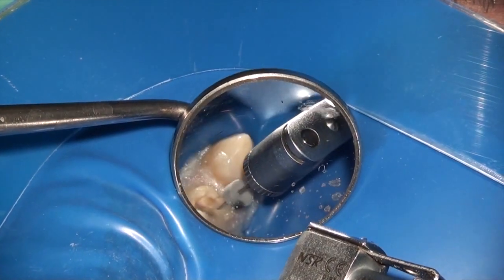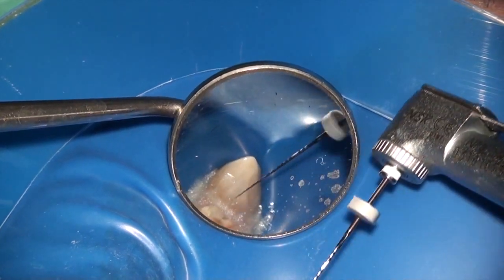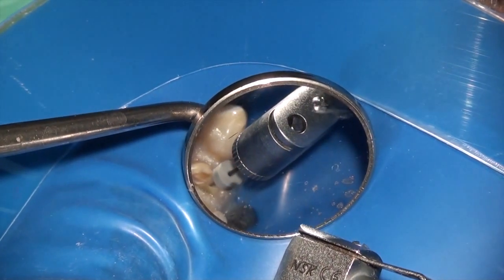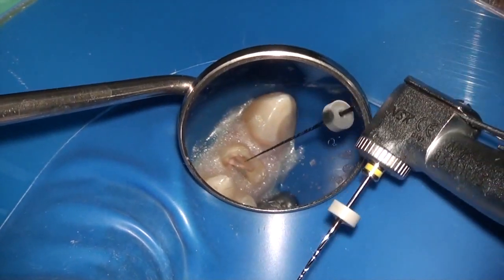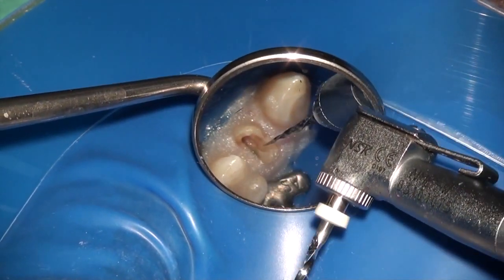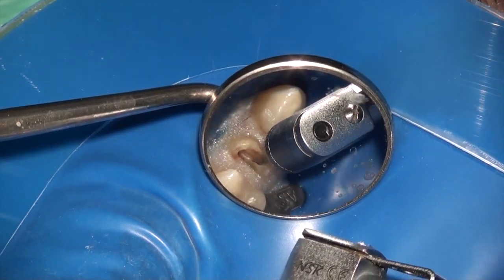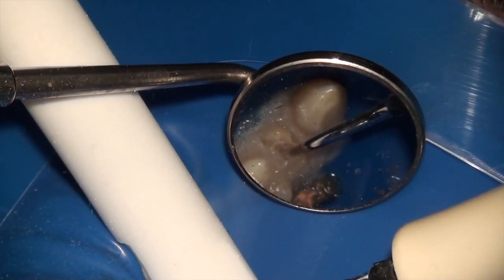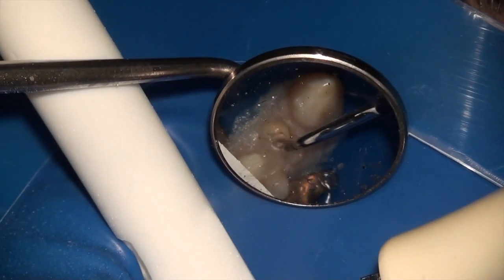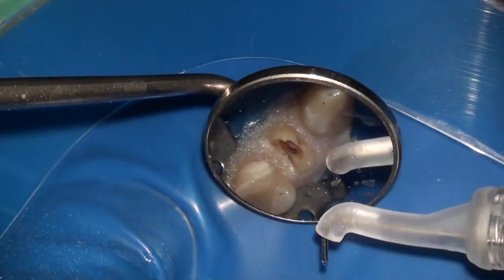This is followed by a size 20. The 15 and 20 are used at about 600 RPM. Once the size 20 has reached my working length, I use my Bio Race 0 for some further coronal shaping. Once that is done, I use the ultrasonic to remove all debris and place some fresh sodium hypochlorite in the canal. Now I'm ready to instrument using my regular instrumentation system.